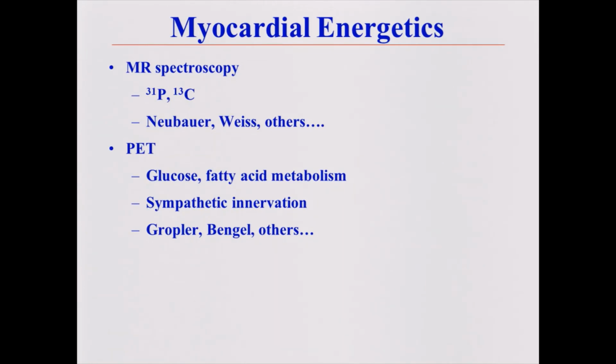But this is a tough measurement to make, and really the Oxford group led by Stefan Neubauer and the Hopkins group by Bob Weiss are the two groups, the premier groups doing this. There's a lot of excitement now in the use of hyperpolarized C13 to image pyruvate, lactate metabolism, and really get similar readouts by MR as that traditionally have only been obtainable with C11 PET.